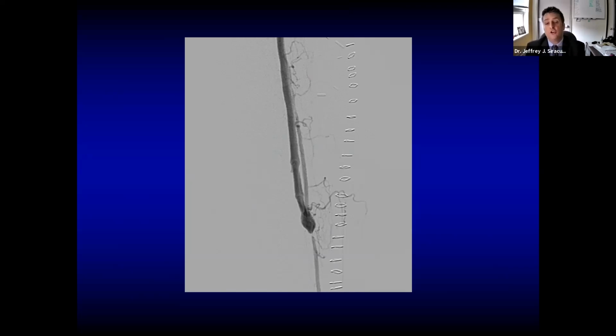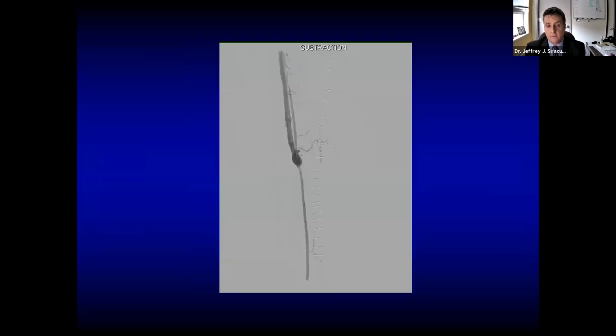One option would have been a complete angiogram, which I don't routinely do, but I'm more open to doing it now after this case. Also, one of my partners, Dr. Farber, who spoke earlier, always uses a tourniquet to avoid this exact situation. Here I got my balloon through, did balloon angioplasty afterwards, and we had a great result. Her bypass has been open for 4 years now.